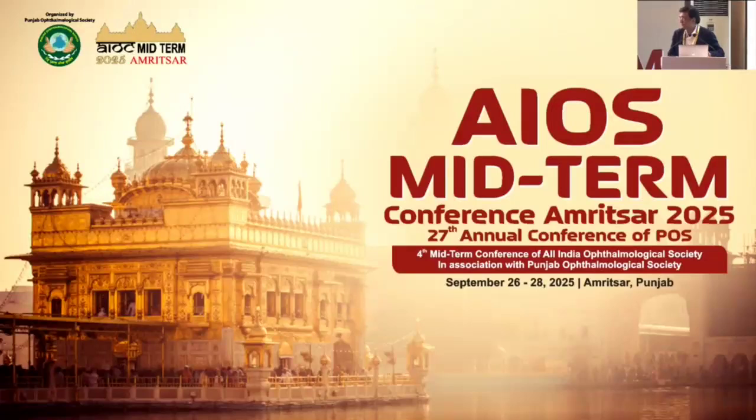Very good presentation. Dr. Ajay Arora has been trying hard in this for the last 4-5 years. Can you tell me what the initial complications in these cases are? I didn't find any complications, sir. Okay, because many center people are not ready to do this. In the beginning, we also tried, but one patient developed secondary glaucoma. You develop secondary glaucoma if your drug is not going into the suprachoroidal space. The technique and experience are required.